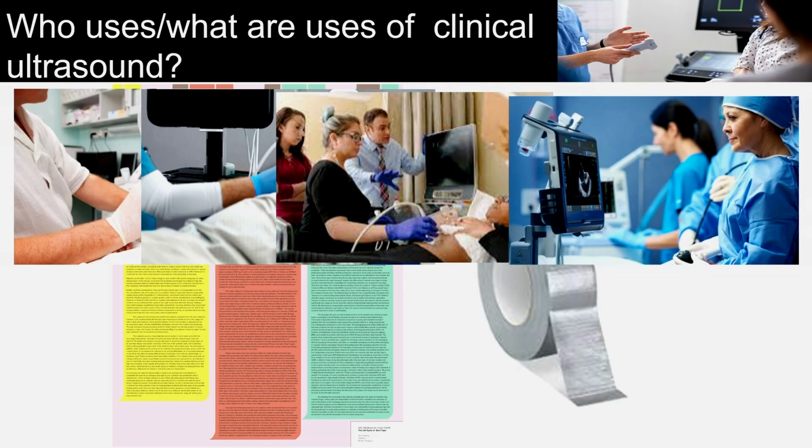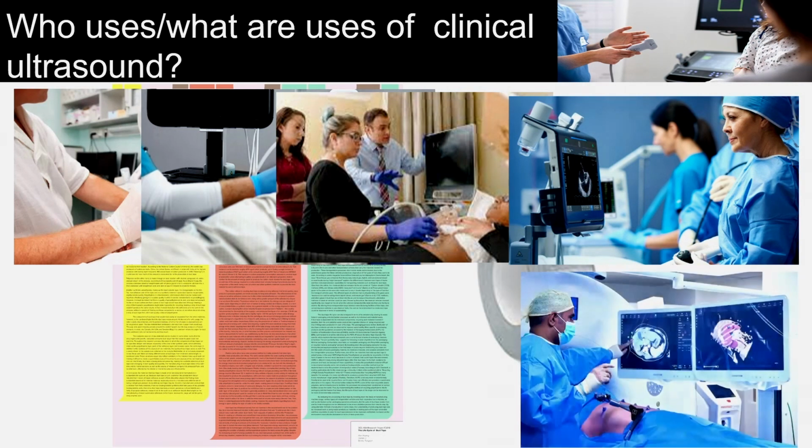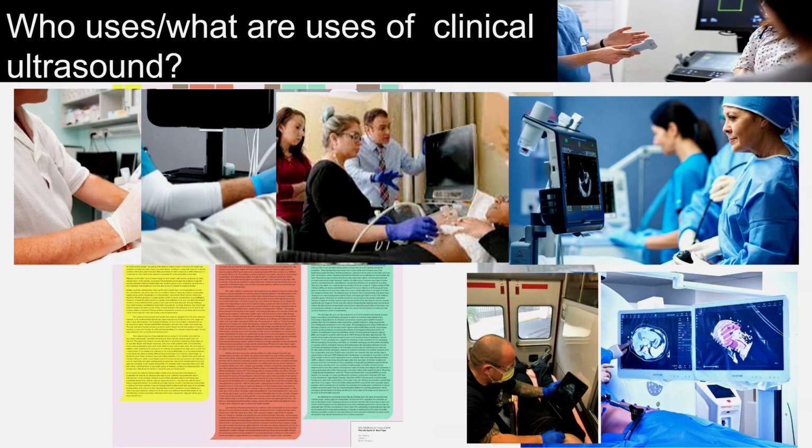Perhaps a cardiologist would use it to study dynamic movement of the heart, to assess its motion, to assess ejection fraction and so forth. Perhaps a surgeon uses it to plan for ablation of tumors as needed. Perhaps a first provider uses it in an ambulance to assess for critical findings of pericardial effusion or ascites in a trauma patient.